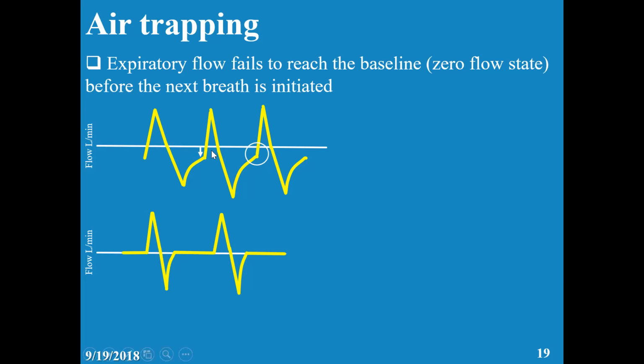You can also do it by shortening inspiratory time, but that's not good. So you can prolong expiratory time, you can shorten the inspiratory time, and you can also decrease the rate. All will achieve the same. But we don't want to decrease the rate if you have normal CO2. And you don't need to shorten the time because you cause dryness of the airway, and the baby starts to be thin and will not be comfortable. So the best solution is to prolong expiratory time. But you can do it all. It can solve the problem.